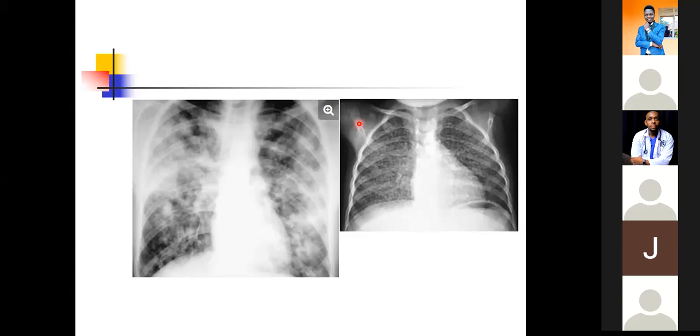So the resolution is way superior to that of plain radiography.